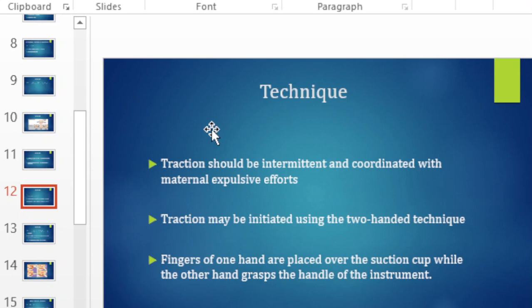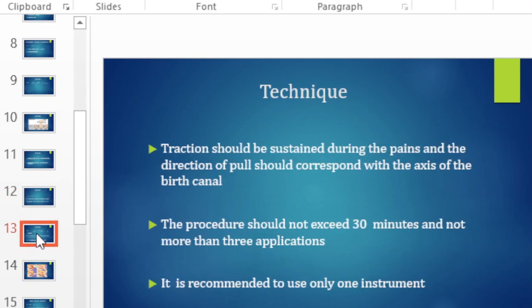Traction may be initiated with a two-handed technique, where fingers of one hand are placed over the suction cup while the other hand grabs the instrument. When there is a contraction, traction should be sustained and directed along the axis of the birth canal. It should not exceed 30 minutes, and you should not exceed more than three applications.